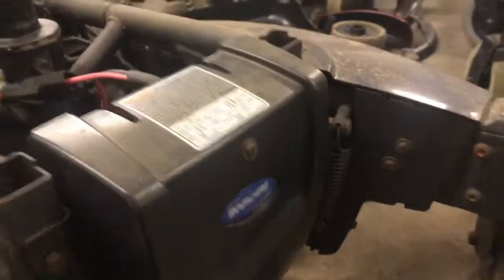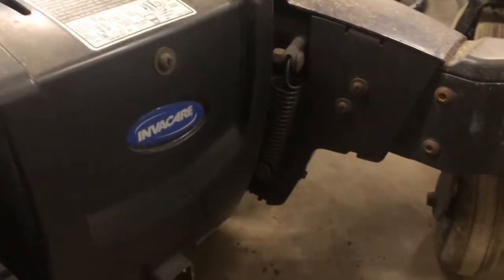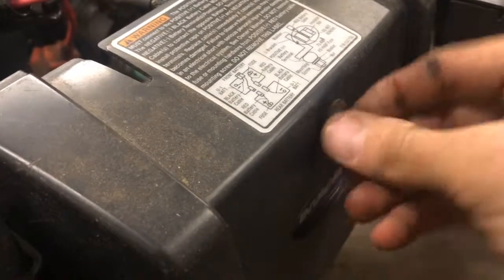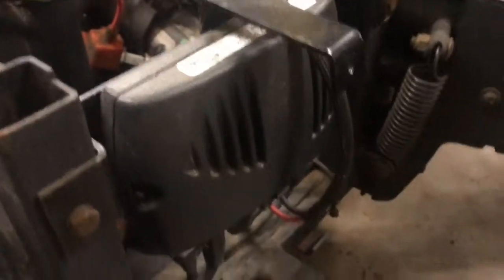Okay, so Phillips. You see my Phillips screwdriver. Oh, upside down. Okay, obviously a different size. A size smaller should work. Make sure you put a lot of pressure on this. You don't want to strip it. These screws are hard to find, so try not to lose them. And this plate should come down to, here's your brain controller.